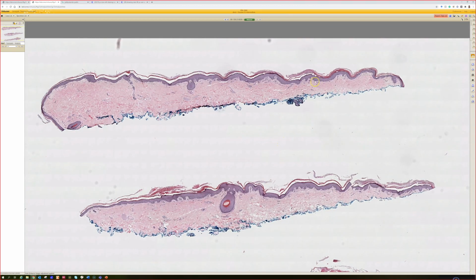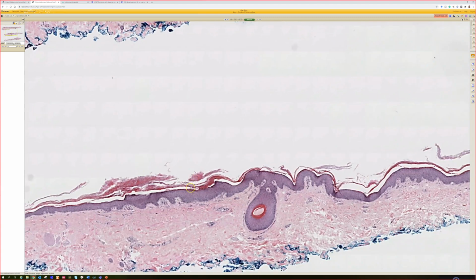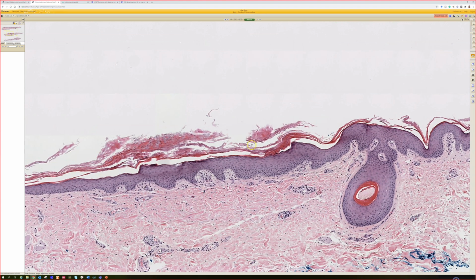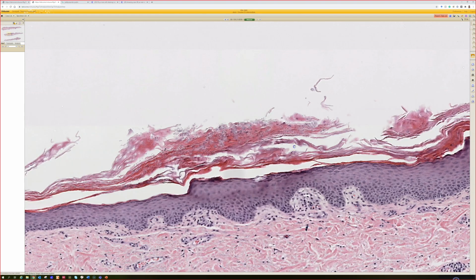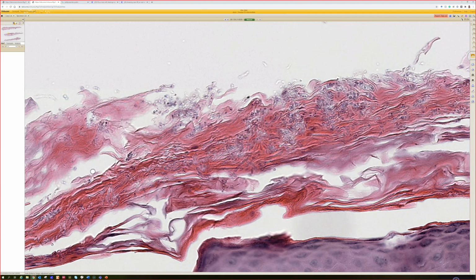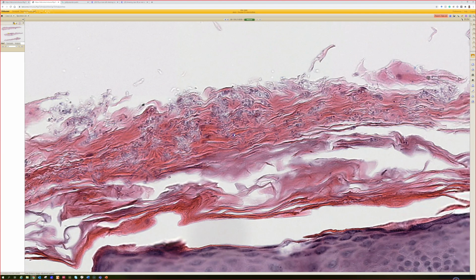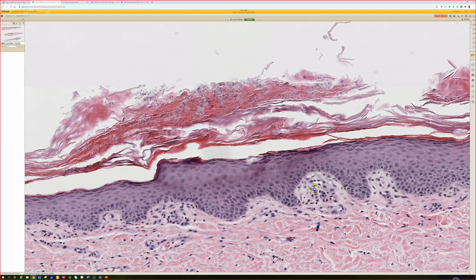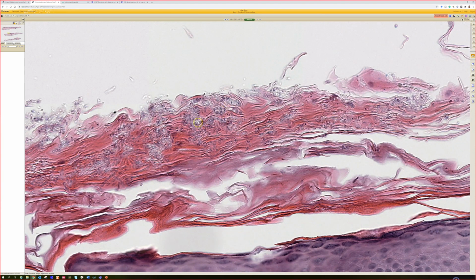Some little mounds of hyperkeratosis. Yep. But everything else at this power looks pretty normal, like not much inflammation in the dermis. Good. When I went in really close on those mounds of orthohyperkeratosis, I could see some little organisms, like spaghetti and meatballs. Good. Little spores and short hyphae, kind of that bluish color that you were talking about, so Tinea versicolor. Yeah, exactly. We're here on the trunk somewhere, and you see bluish hyphae and yeast, well, then it's going to be Tinea versicolor.